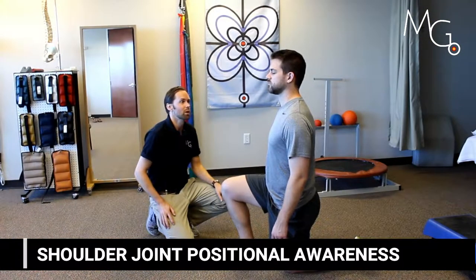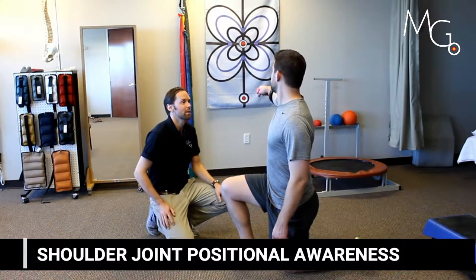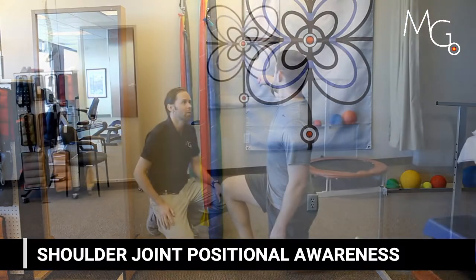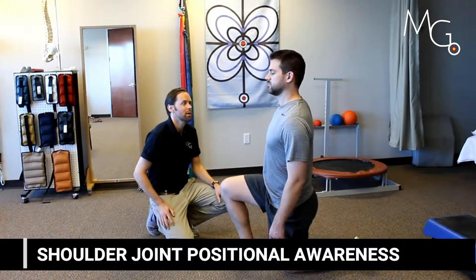One really useful application of the motion guidance system is testing joint positional awareness of the shoulder. You can simply have the patient locate the target, close their eyes, and try to get back to where they thought they were in space.